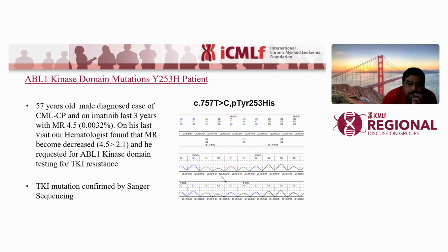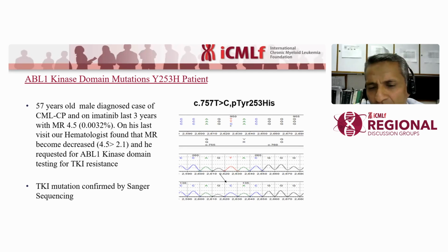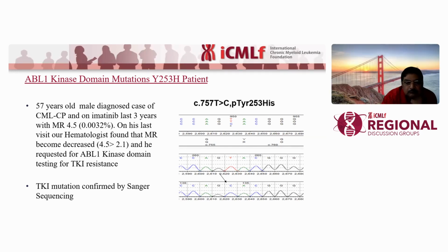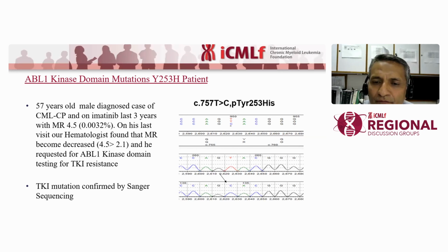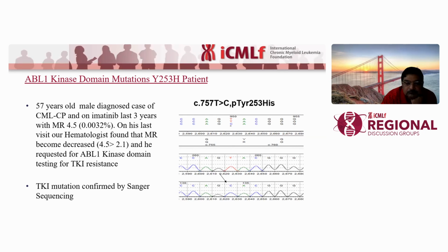The second thing is that we also maintain quality control. We usually receive specimens in the Tempus tube to stabilize the RNA. We also audit the RNA-stabilizing transport quality: if we receive the specimen within 24 hours, we are happy to do the test.